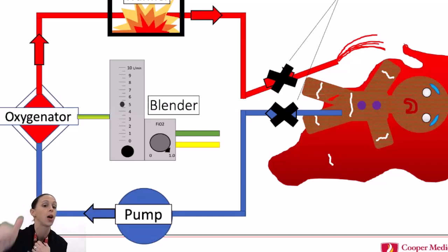So we've called for help, we've clamped off, we've turned off the pump, and let me go back to the actual scenario that happened to our patient. Of the two potential possibilities, either that return cannula was going to be totally out, or, in what actually happened, the tubing had popped off. The patient had been turned, there was probably a little bit of a tug, and it popped off. So we were bleeding from the cannula, which fortunately was still sutured in and was in perfect position.